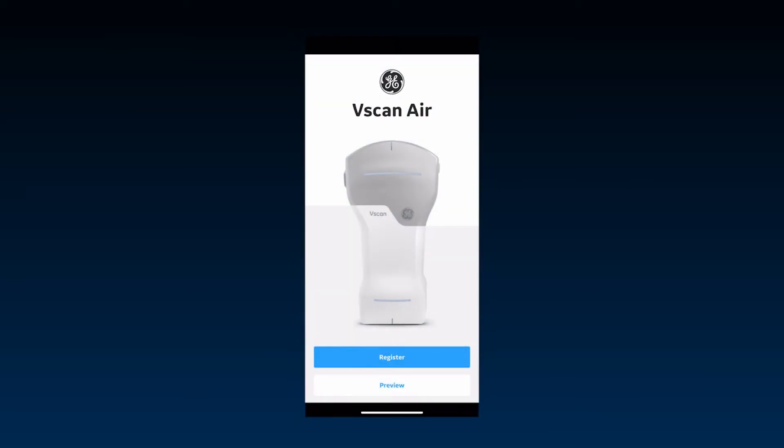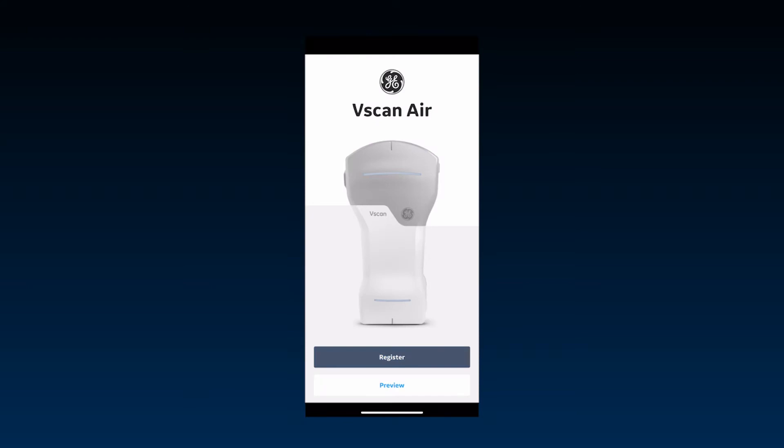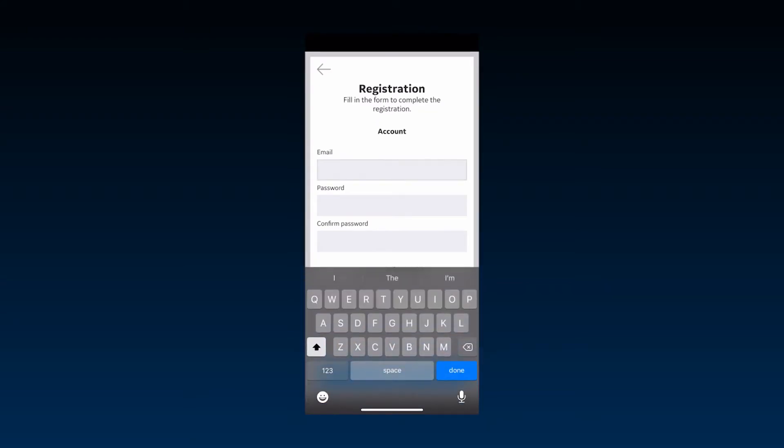Let's see how to connect your vScan Air Probe with the vScan Air App. Before connecting, the probe and app both need to be registered. Watch the video on installation and registration to see how to activate your device.